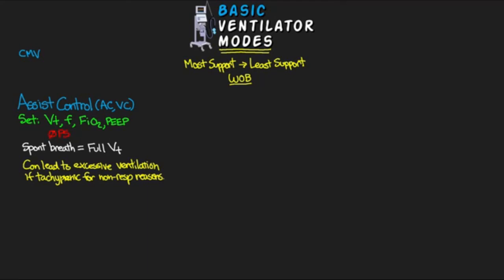All right, so because of some of these problems that we just talked about with assist control, and also because of a desire to want to be able to have a mode that can really help with weaning our patients down off the ventilator, another mode was developed. And it's something that we call synchronized intermittent mandatory ventilation, something that goes by the name SIMV.